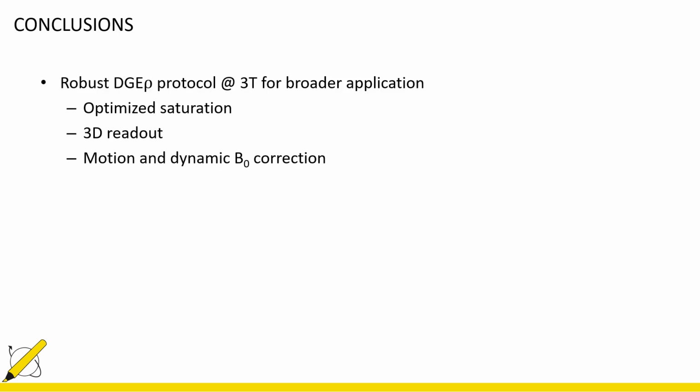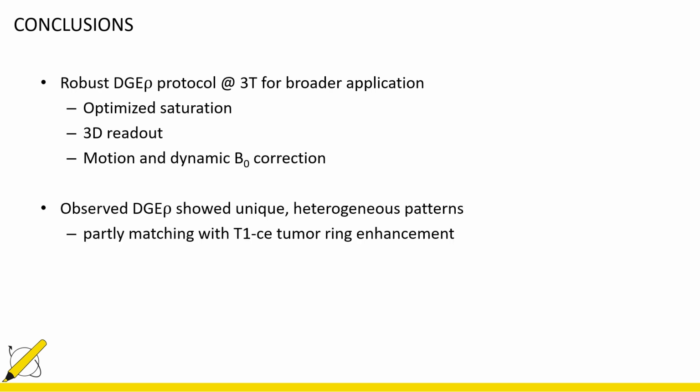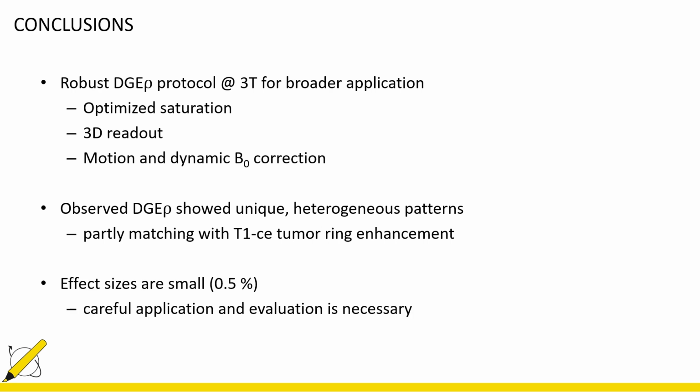So in conclusion, by optimizing our saturation, our 3D readout and our post-processing steps, we were able to set up a robust DGE protocol at a clinical field strength for broader applications. The DGE maps we observed showed a unique and heterogeneous pattern, which was partly matching with the gadolinium enhancement regions. Still, the effect sizes are very small, and therefore a careful application and evaluation is necessary.